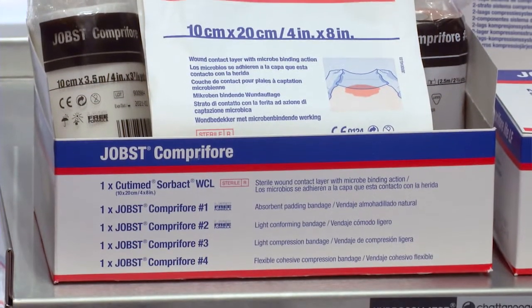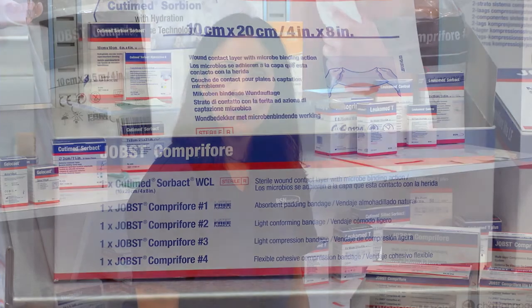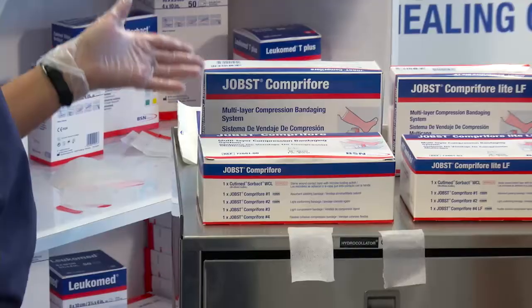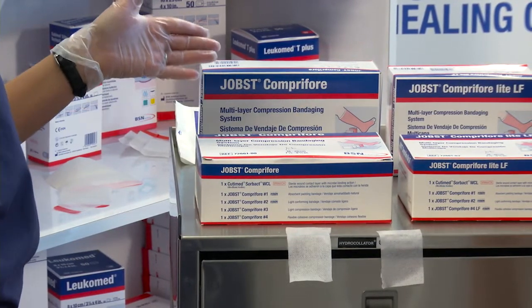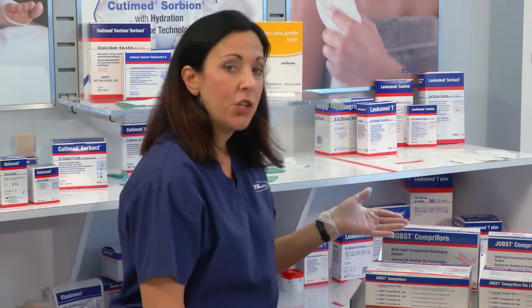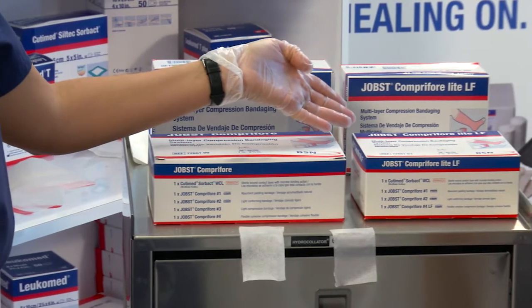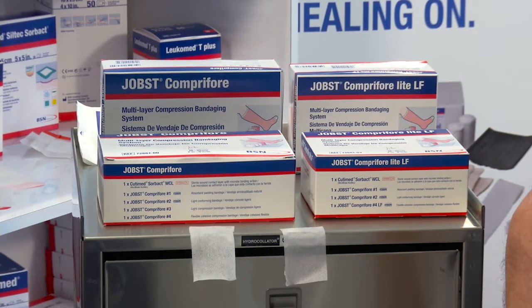Today I'm going to demonstrate the application of Jope's Comprofor. Jope's Comprofor is a multi-layer compression bandage used to treat patients with venous leg ulcers. It comes in two compression classes. Jope's Comprofor delivers 40 millimeters of compression and is for patients with an ABI of 0.8 or greater. If your patient has mixed arterial and venous disease, Jope's Comprofor Light is for patients with an ABI of 0.6 to 0.8.